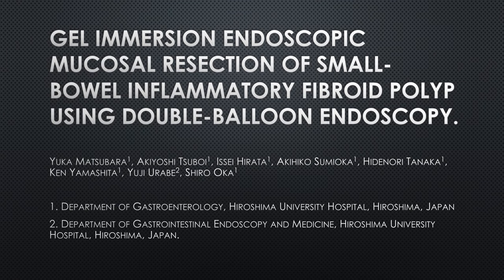Endoscopic mucosal resection of small bowel inflammatory fibroid polyp using double-balloon endoscopy.